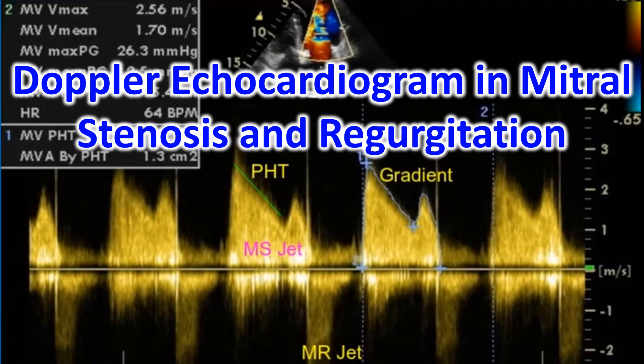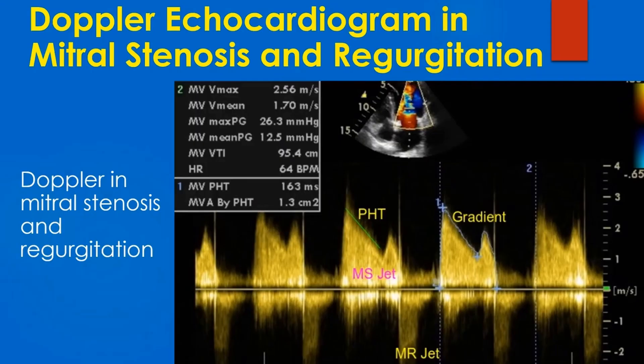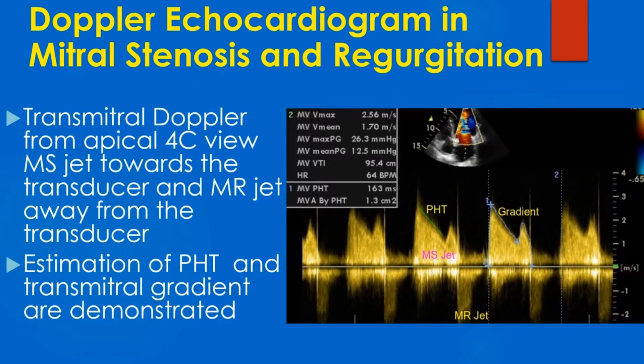Doppler echocardiogram in a combination of mitral stenosis and regurgitation. Here is a tracing obtained by Doppler interrogation in mitral stenosis and mitral regurgitation. Transmitral Doppler from the apical four-chamber view shows the jet of mitral stenosis toward the transducer and the mitral regurgitation jet away from the transducer, below the baseline.